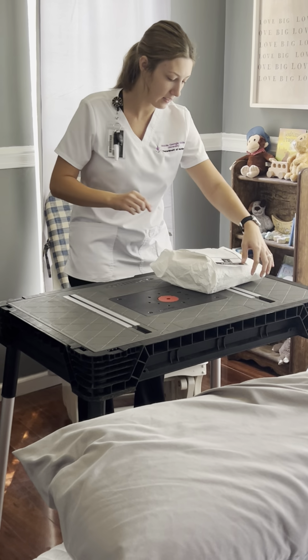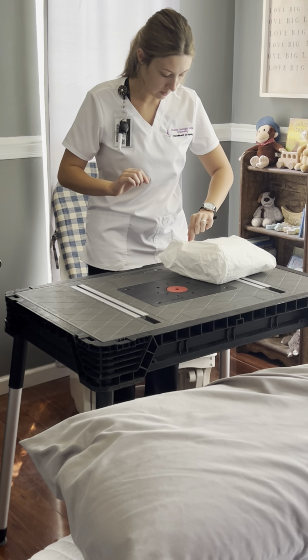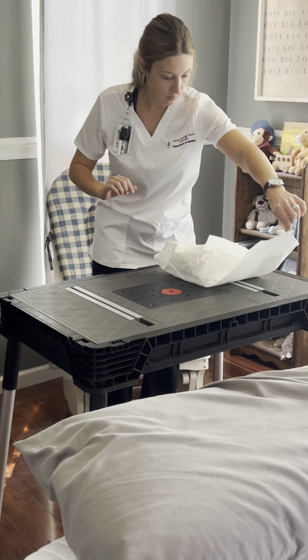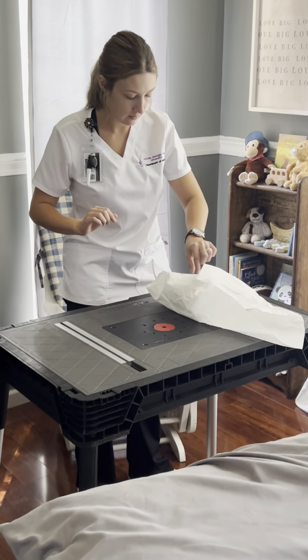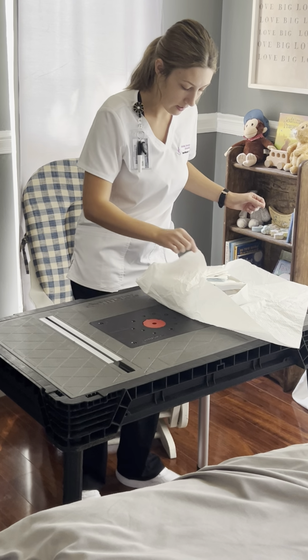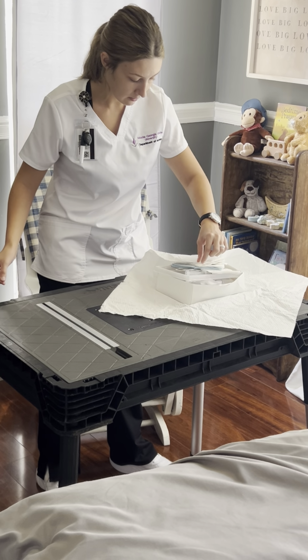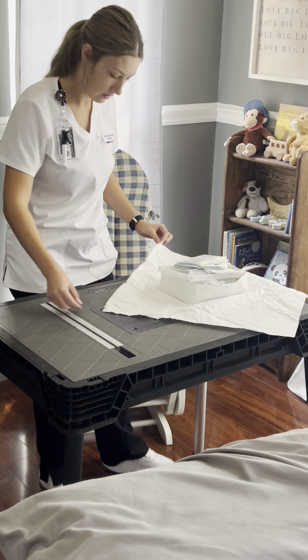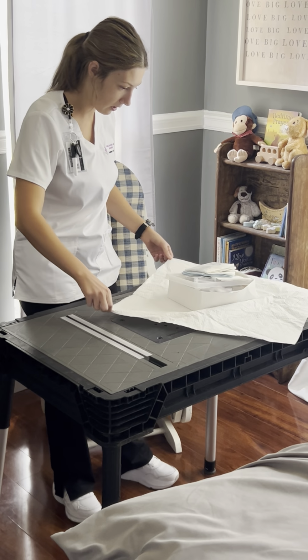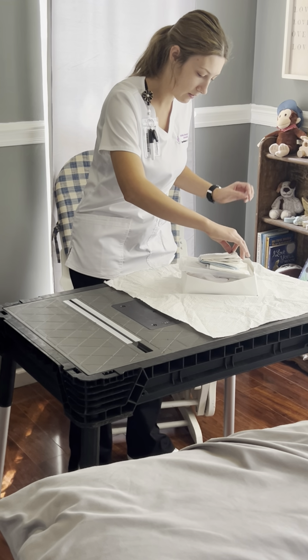Remove that. Also, I'm going to do 1-inch borders. Furthest away. Side. Other side. And closest to me. I'm going to square my box. Perfect. I'm going to remove my gloves.